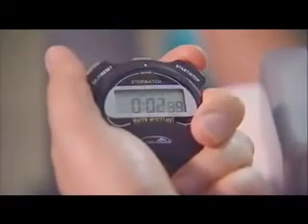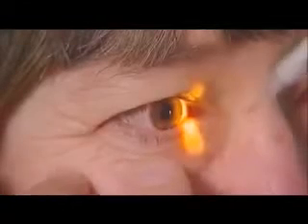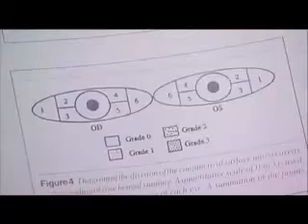2. The sequence of measurement of the TFBUT and staining. In many clinical trials, the average of 2 or 3 measurements of the breakup time is required by protocol. This is time-consuming, and the delay may influence the quality of measurement in the second eye. For this reason, it is more appropriate to instill dye first in the right eye, recording the breakup time and grading staining in that eye, then on the left, making the same measurements there.